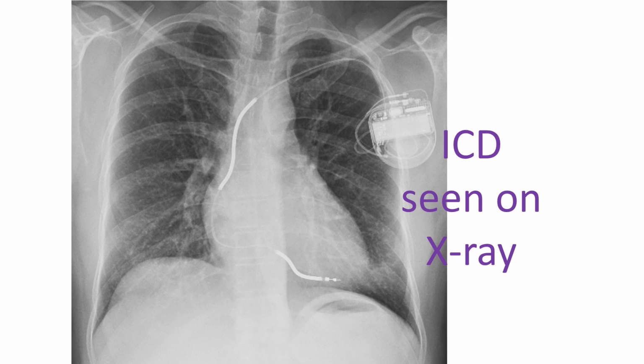Another special type of defibrillator is the implantable cardioverter defibrillator or ICD, also known as automatic implantable cardioverter defibrillator or AICD. This device is physically much smaller but has a long battery life and is expensive. The device is implanted under the skin by a minor surgical procedure. It has advanced electronic circuitry which automatically analyzes the heart rhythm and delivers appropriate electrical treatment automatically.